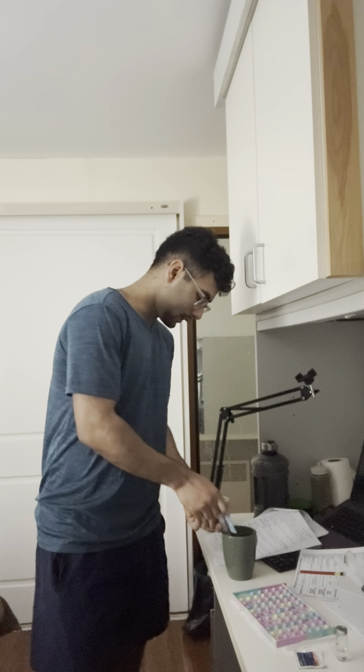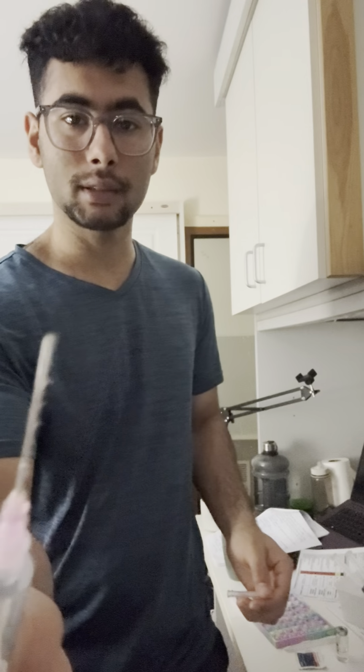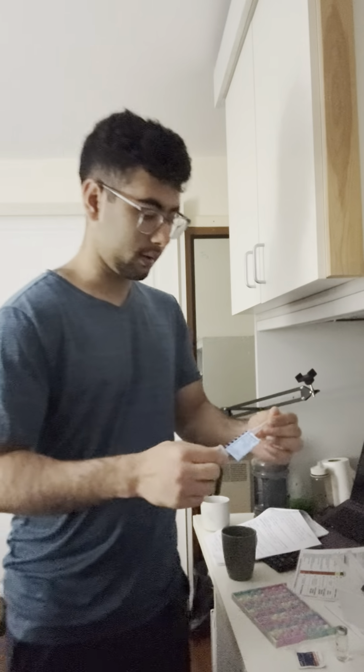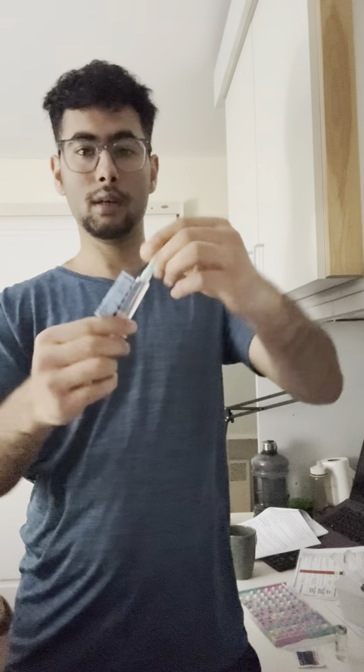So I'm going to take it like this, draw 10 ml. This is actually not a 10 ml, I think this is a 5 ml, but let's assume this is a 10 ml as well. And we draw with the drawing up needle as well. The drawing up needle is really not sharp, it's blunt here. Then we take it out because we just use it for drawing up. We're going to chuck this in the bin, and use another one, this one, right?